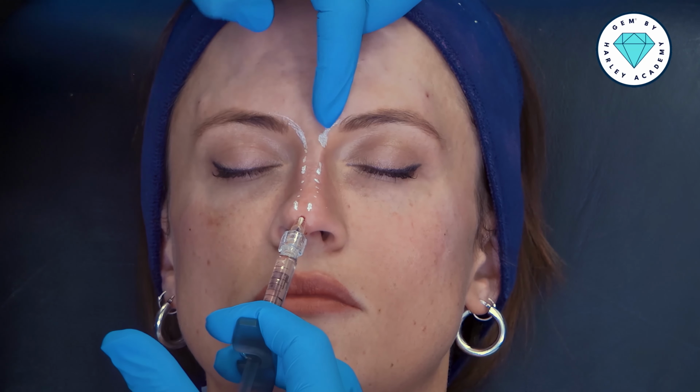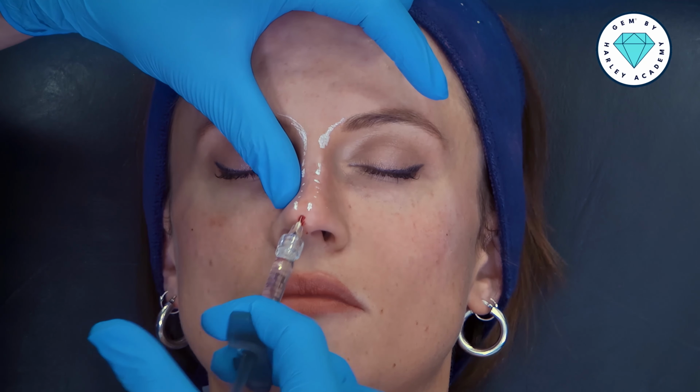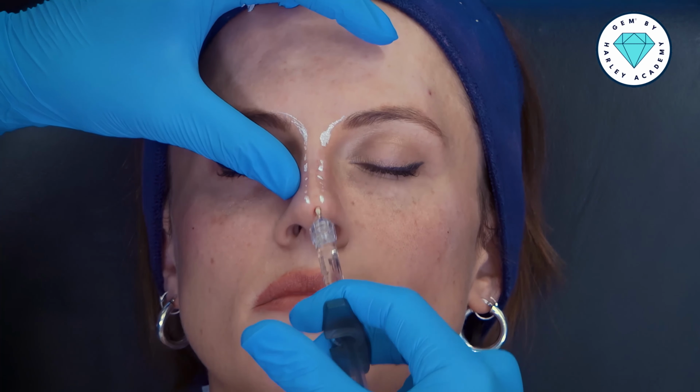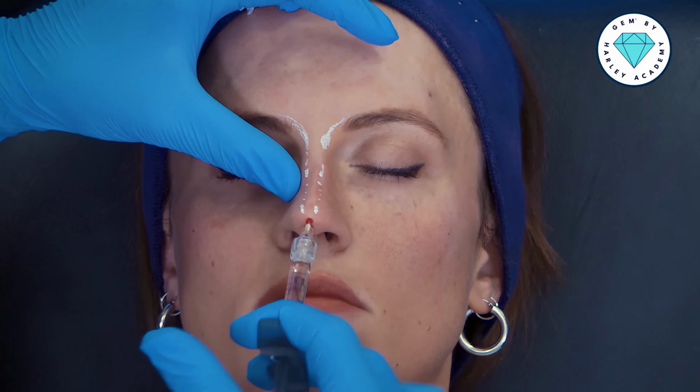I'm focusing here on the left aesthetic line, adding some volume to the midline, and then to the patient's right aesthetic line. 0.1 mil of Revanesse Shape injected so far. I'm going to stop injecting at the dorsal hump because there's already some projection, and then I'm going to move below the dorsal hump and start injecting again.